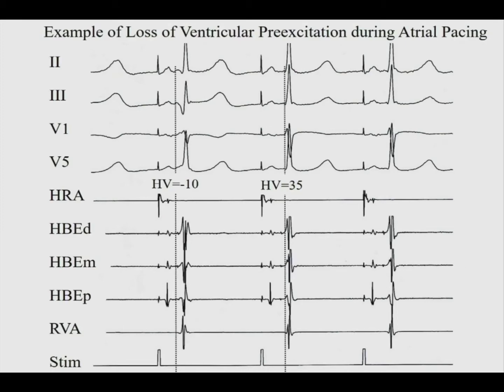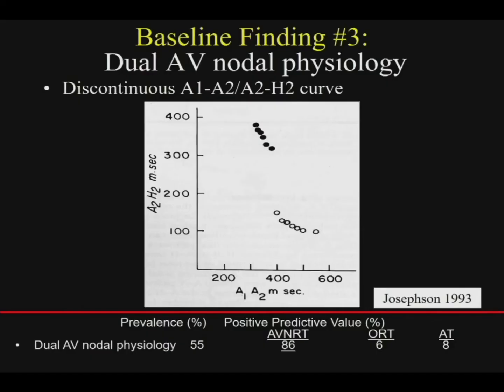So this sounds simple, but you have to make sure you understand the principles here. The local appearance here doesn't change. You're not measuring the HV from the H to this V. It's to the earliest V anywhere, which is typically where the pathway inserts.